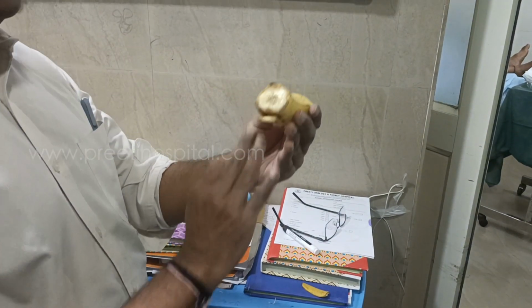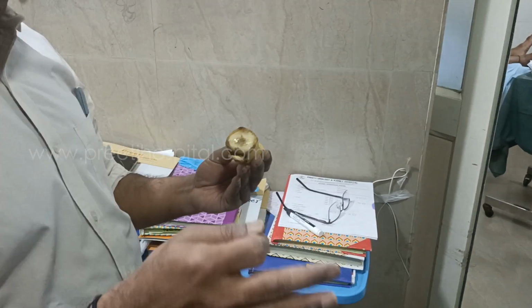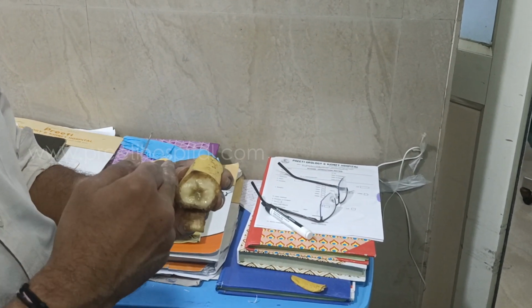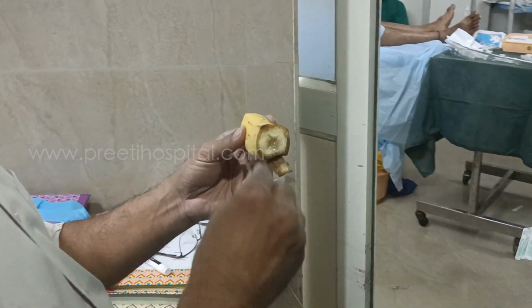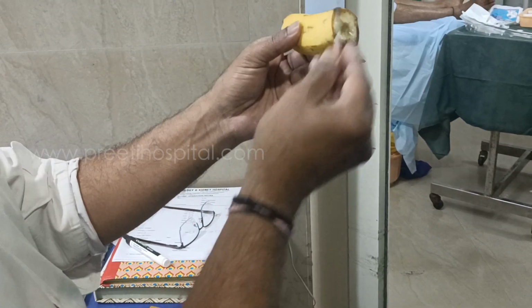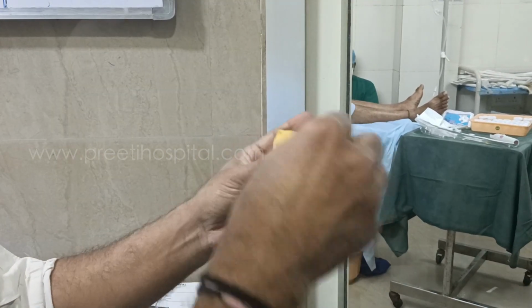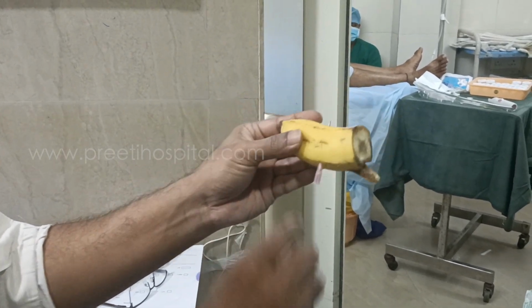So these are all axial. These are all sagittal. In axial, right left is there. In sagittal, right left is there. In axial, posterior posterolateral is there. In sagittal also, posterior posterolateral is there. But who will take anterior? Because your probe cannot do this anterior. You can do it, but it won't come. So with end firing and a long needle, you take it, see, anterior has come. You can never take this part of the banana with this sagittal. So every time, for example, if a lesion is here, you have to go like this. Then that piece will come.